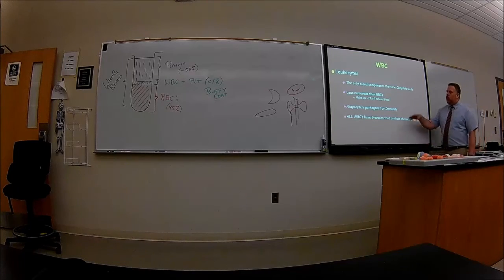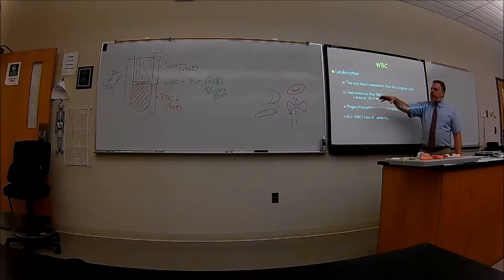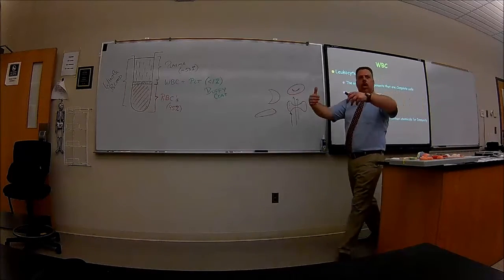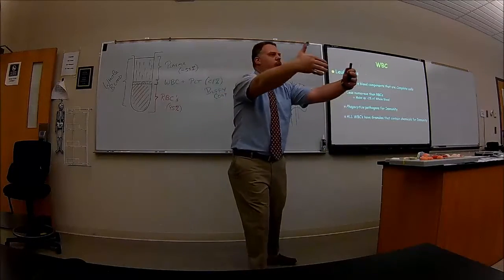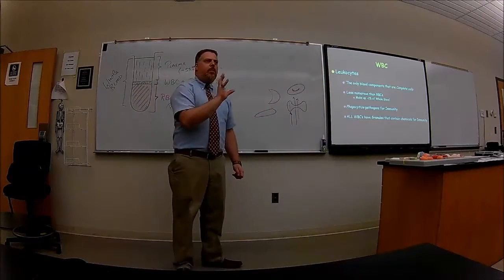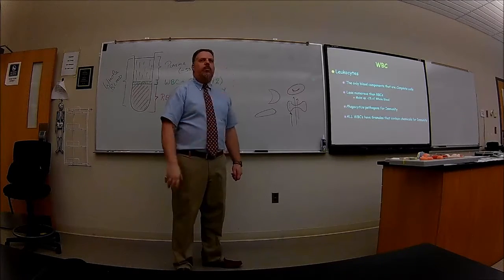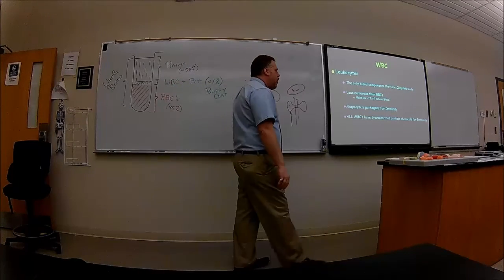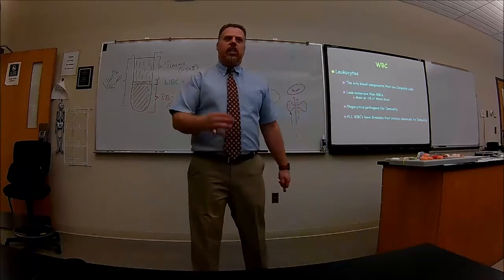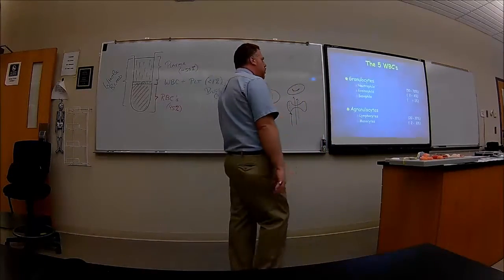Okay? Look, white blood cells, I just explained everything up there. Less numerous, they make up less than 1% of your whole blood. They phagocytize. They're going to be our police that are going to engulf the bacteria or viruses and break them up. And what happens with them after that, you'll learn in immunology and lecture. Okay? So keep in mind, all white blood cells have granules. You just can't see them with our microscopes here in certain ones.